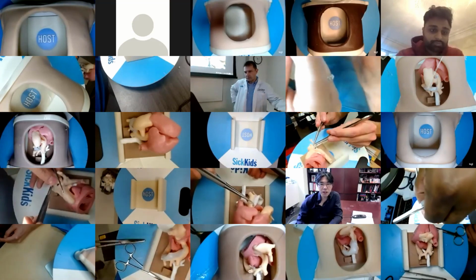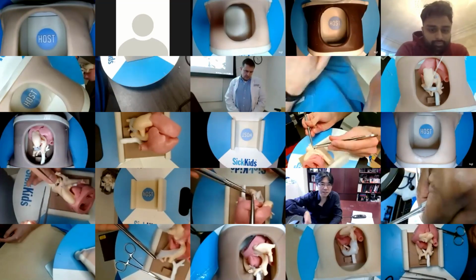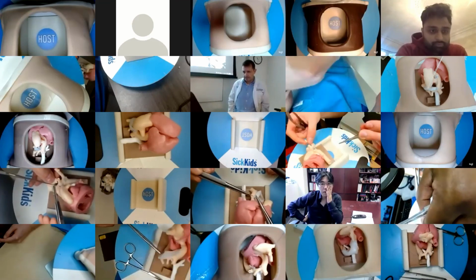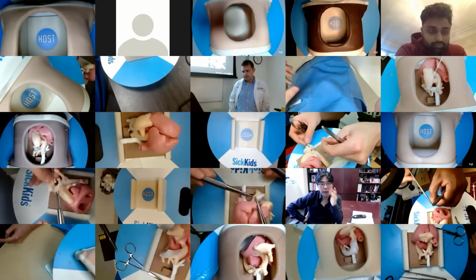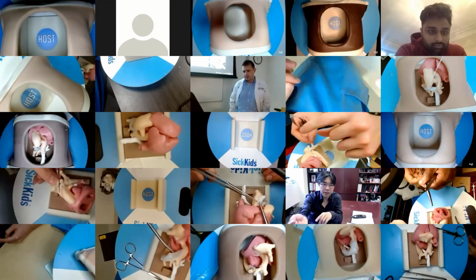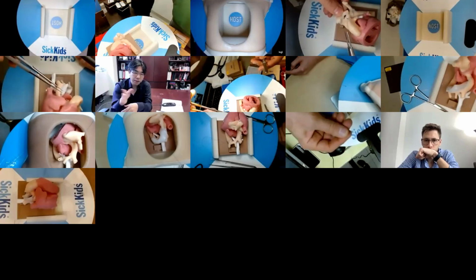It's really straight all the way from the descending aorta to the ascending aorta, which is kind of interesting. So either no trimming on that part whatsoever, or when I get the lesser curvature suture line to the DKS, I have a rough idea of how big this bulging will be, and if it's too big, I'll trim a little bit.